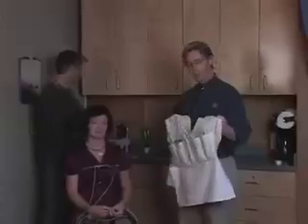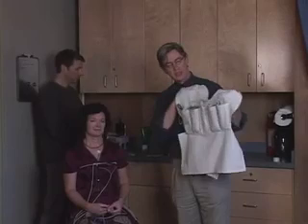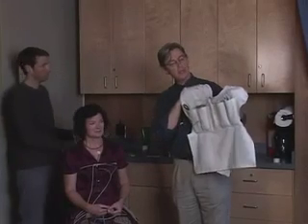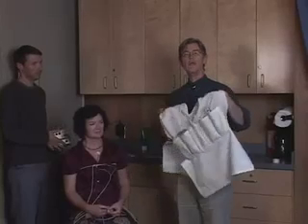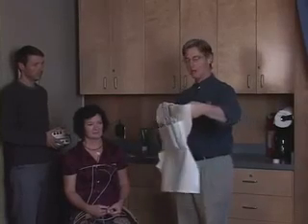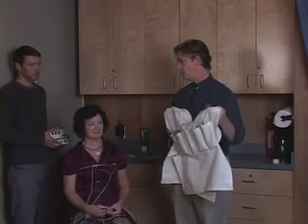We're now going to demonstrate the electrophysiology component of our research. What we have here is our electrode vest, and we have placed all of the different electrodes into the pockets that we've designed for maximum efficiency and comfort in setting up this part of the preparation.